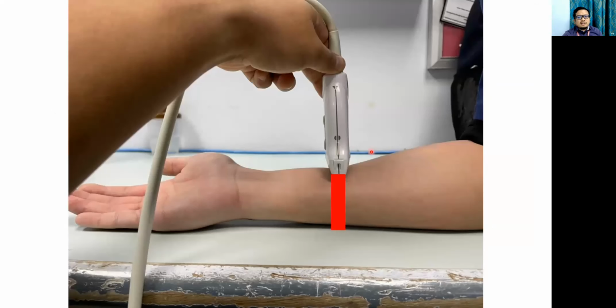The last thing about orientation of the probe is that whenever you turn the probe in any different direction, you have to remember the probe will only convey the image to you in the direction of the ultrasound. If you put the ultrasound straight like this, it will produce an image of exactly this block and slice.